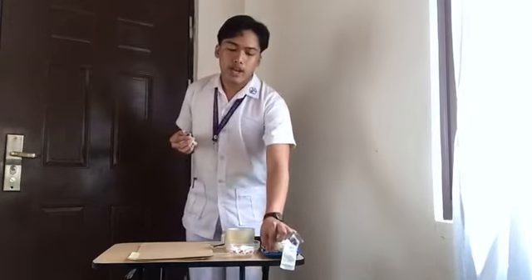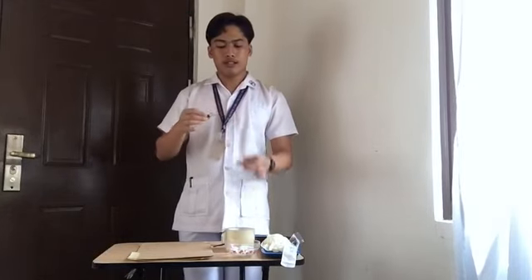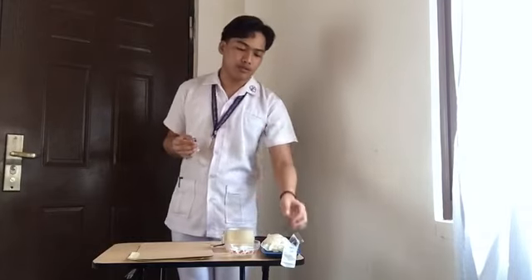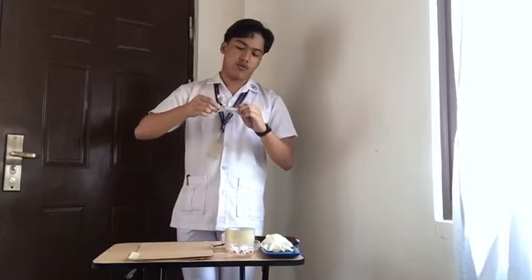Next is dispose of the filter needle by placing it in a sharps container. So I am going to dispose of the filter needle. And if giving an injection, replace the filter needle with a regular needle. Tighten the cap on the hub of the needle and push the solution out of the needle to the prescribed amount. So I am going to insert the main needle.